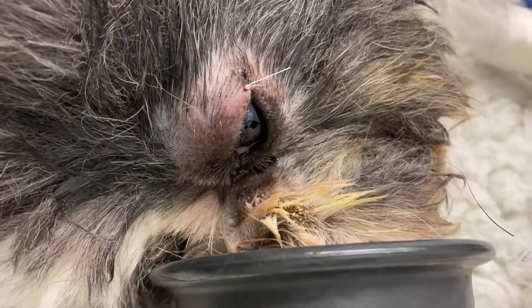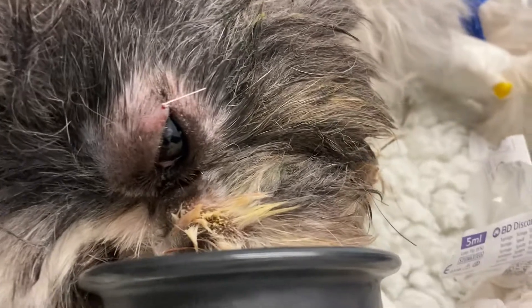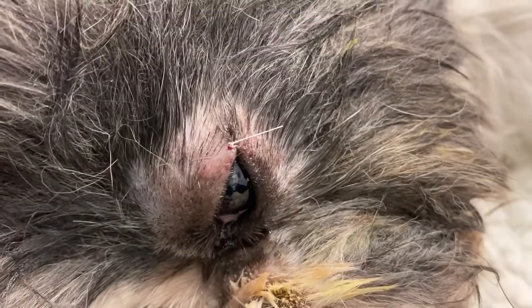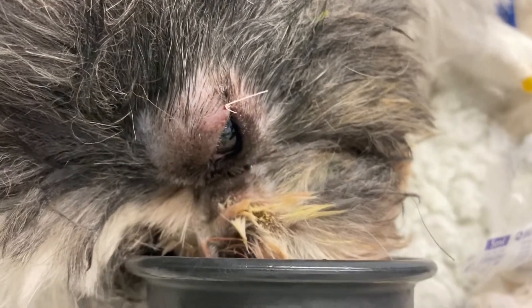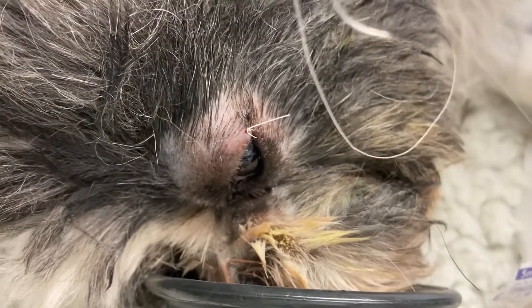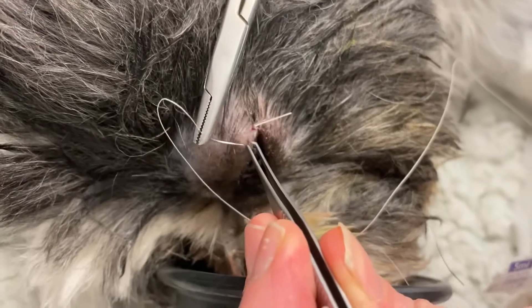These stitches should just stay in for the first few days, probably about a week or so after the procedure has been done, before removing them and the contact lens once healing has taken place.